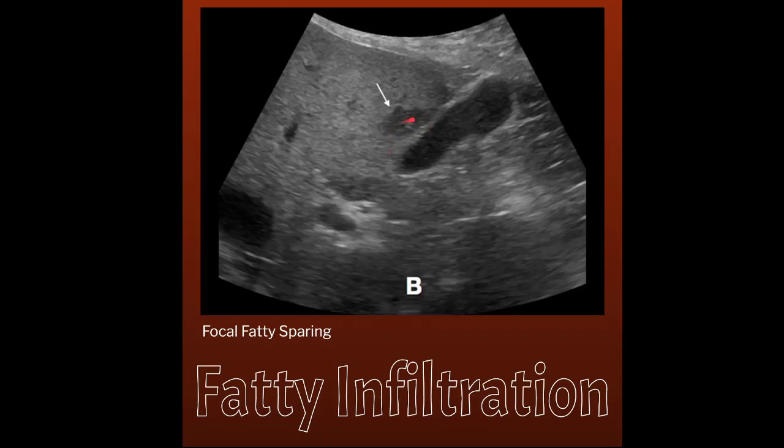I don't typically measure these, mostly because measured items need to be followed up, where this is a very benign finding. They're not going to want to follow this up in 6 months. But I still go through long and trans pictures of this with color just to show the radiologist that I saw it, and if they have a different idea on it, if they do want it followed up, then there's images of it and it can be measured on the PACS system.